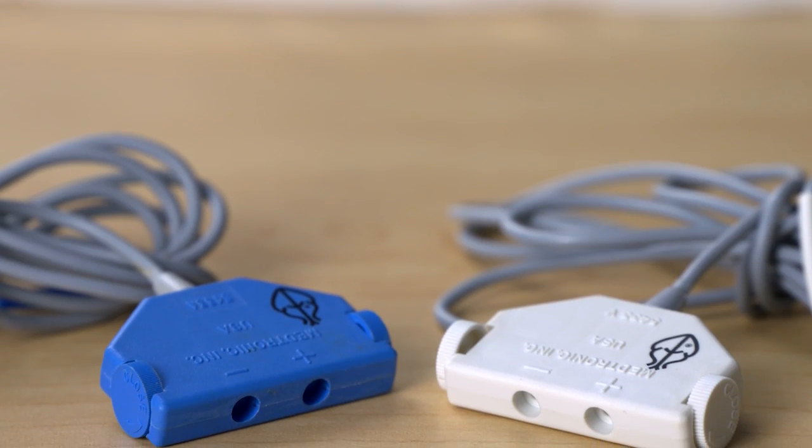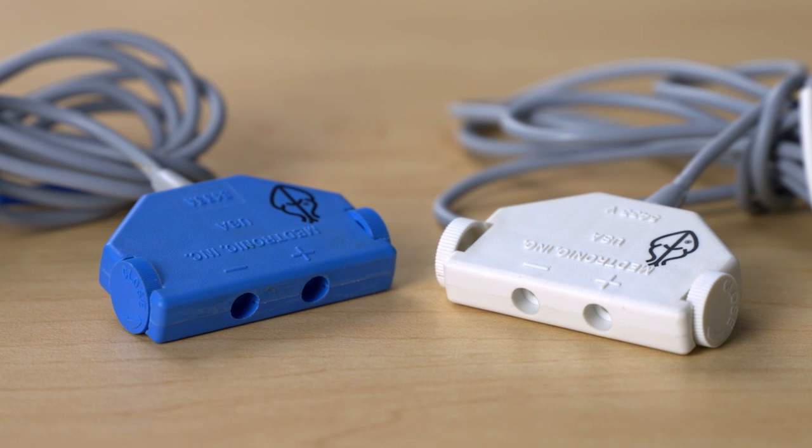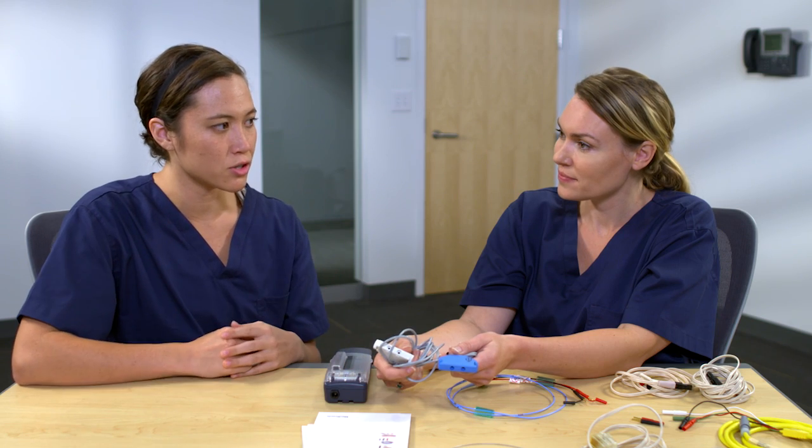So the beige ones are only used once and the gray reusable ones can be cleaned and reused. Just be sure to check with your institution's policy on sterilization and disposal. The technical manuals also have information on how to sterilize the cables. Now I'll show you how to connect a pacing lead to a 5433 cable. The connector blocks are different colors: blue cables are for atrial pacing and white cables are for ventricle pacing — same cable functionality, just color-coded for the heart chambers.